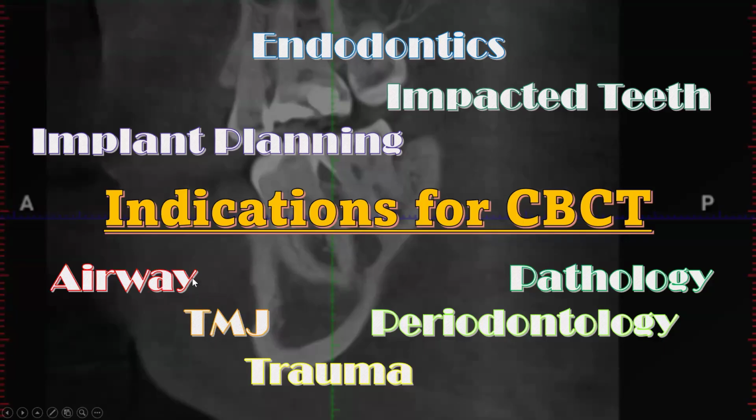Also airway analysis, that's somewhat controversial, but I will include it for some of my reports when I see that the airway looks constricted. That's obviously not diagnosing sleep apnea in someone, but it is a risk factor. And it's a serious condition that's very common. And so I feel good about commenting on it when I see it, right? I think you could be doing patients a lot of good. And a lot of dentists get into treating airway, and you're not typically diagnosing.